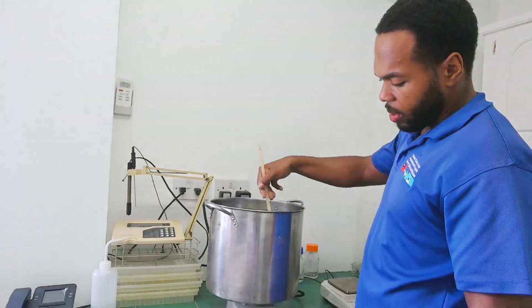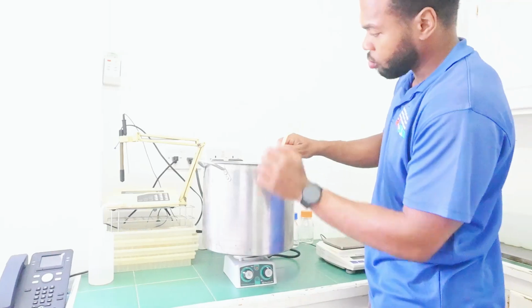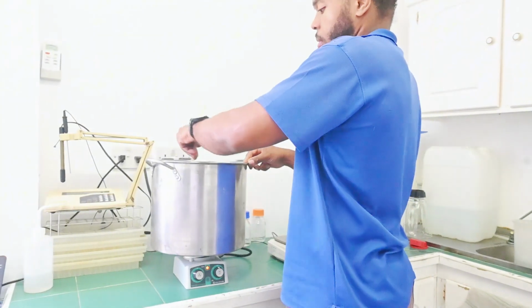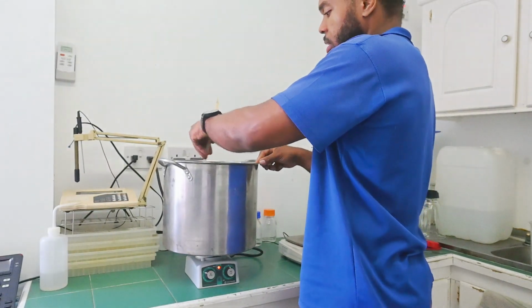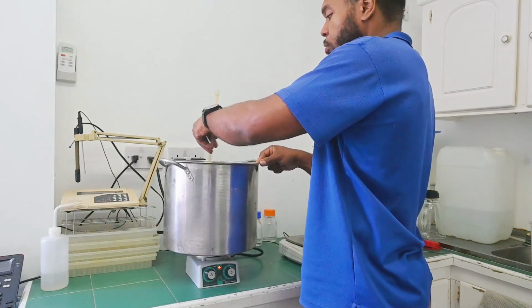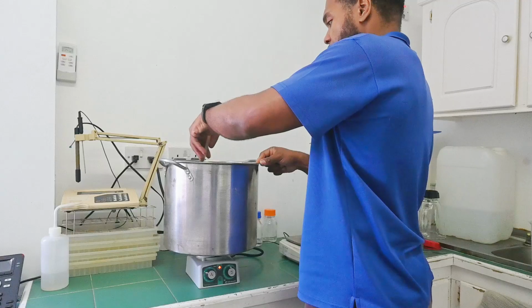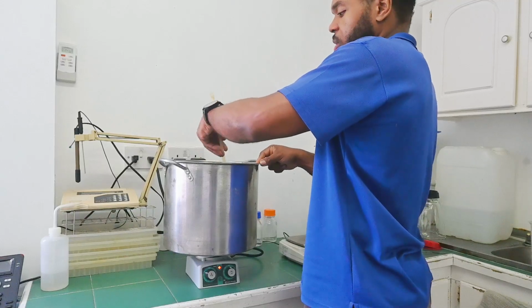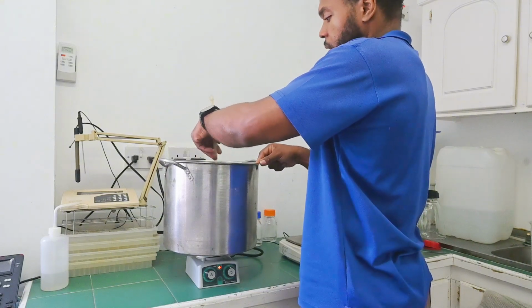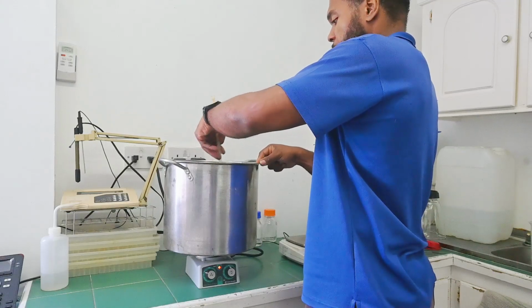So what it is on while we are stirring is called a hot plate. What it's for is to heat up the contents of what is in the pan. We have to get the media to at least 25 degrees or room temperature so that the reading of the pH meter is accurate. Why this is done is because a lot of the stock solutions are in the fridge. So even if you add the room temperature water, the temperature will still be below the 25 degrees, so we have to raise it to the level it needs to be before we can get an accurate reading.